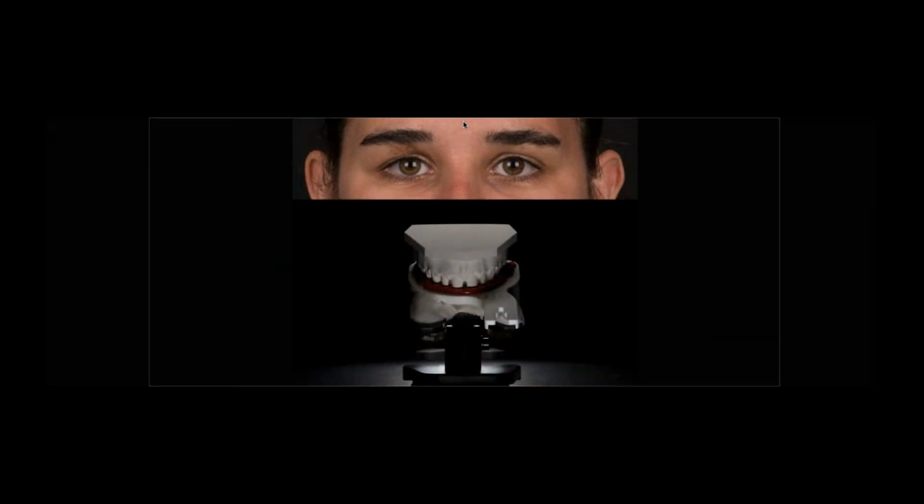And then when I have this picture, I place my model on the, how do you call this? It's like a table for articulating, and you can see the angulation of the model goes a little bit like this, but the back side of the model is always parallel with the bipupillar line.